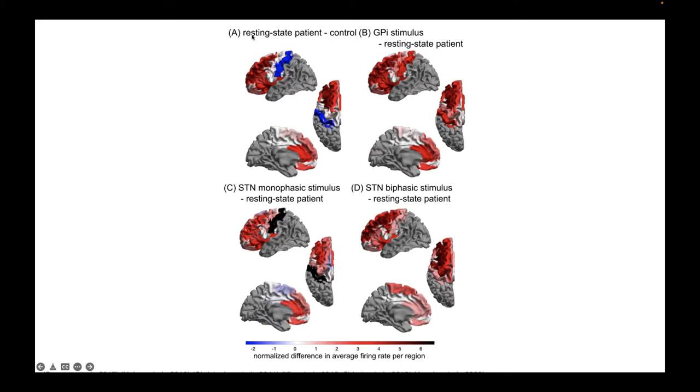Simultaneously to all these spikes, we can see regional activity, right, of all of the cortical regions that we simulated, which were actually all of the ones that were not gray. So the gray ones here were not included in the Peterson Atlas. So unfortunately, in this first study, we could not see their reaction to the stimulus. So, and later on, I will show you a different video where you can see the whole brain. Of course, that was one of our first things to improve. But this detailed atlas helps us to simulate the activity of all of these other cortical regions.